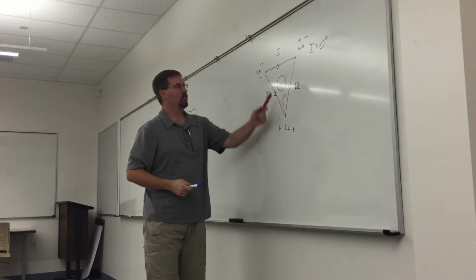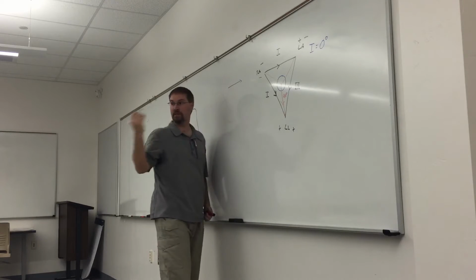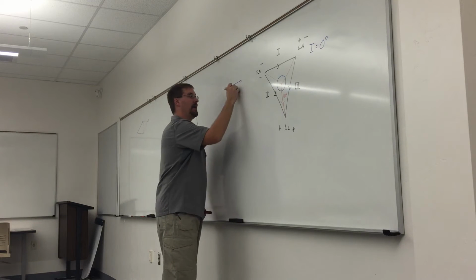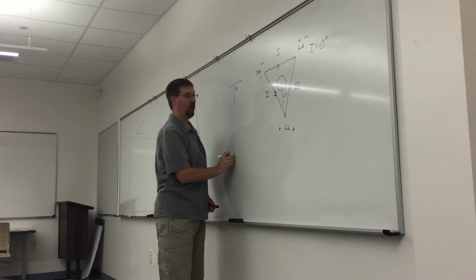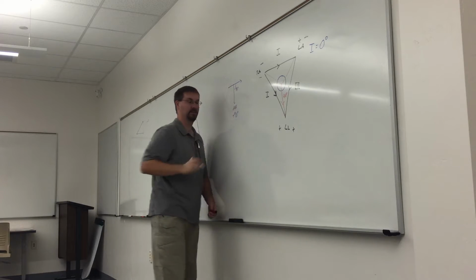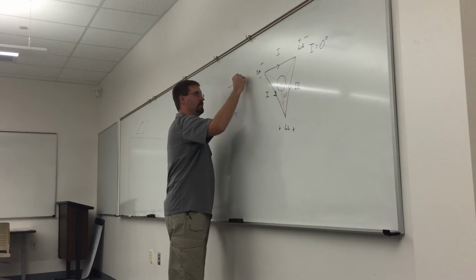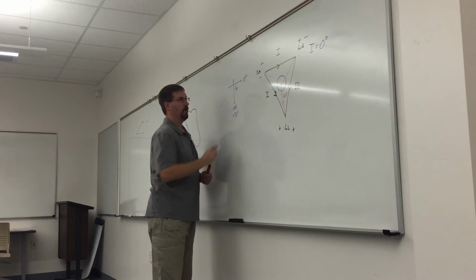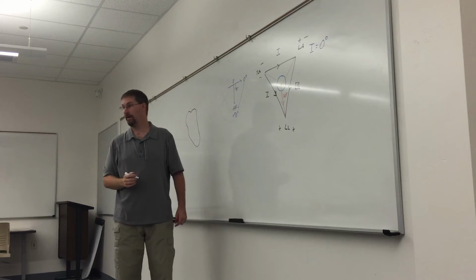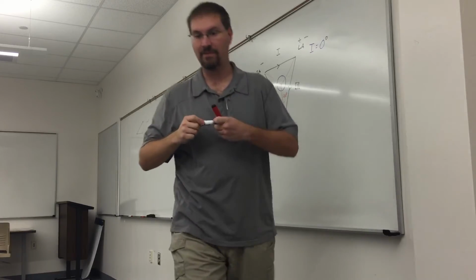And AVF is what to lead 1? So if I draw a line like this, it's perpendicular, right? It is at a what angle to lead 1? 90-degree angle. So why not just call AVF positive 90 degrees? Are you guys cool with that? And I'm going to call lead 1 0 degrees. All right, so from 0 to positive 90 degrees. Are you guys cool with that? Is everybody okay? I don't want to lose anybody early in the game here, so I'm just going to build it up slowly.